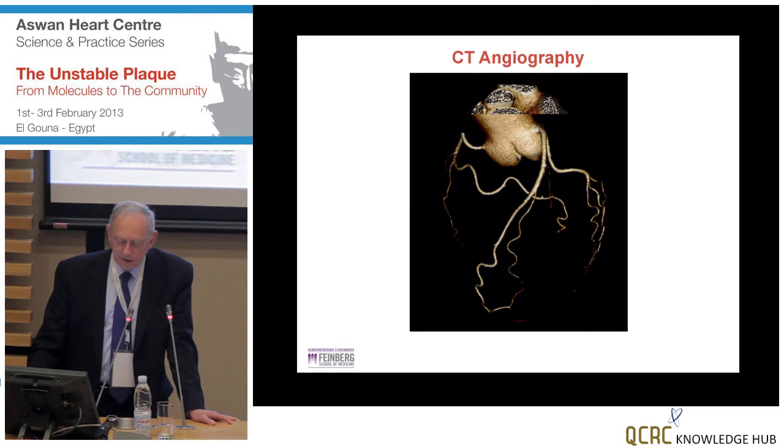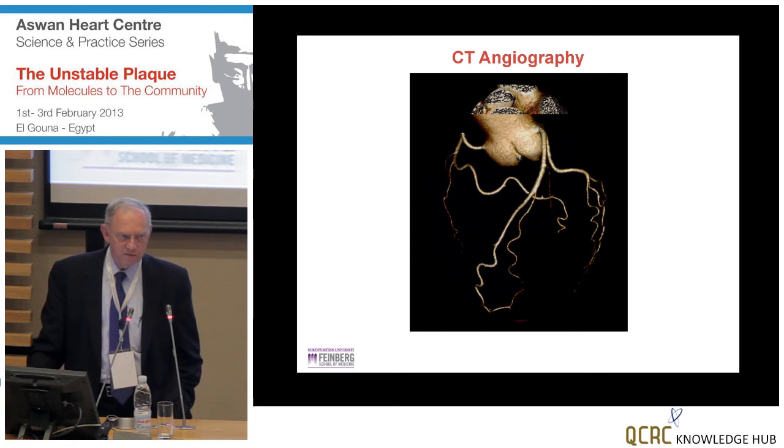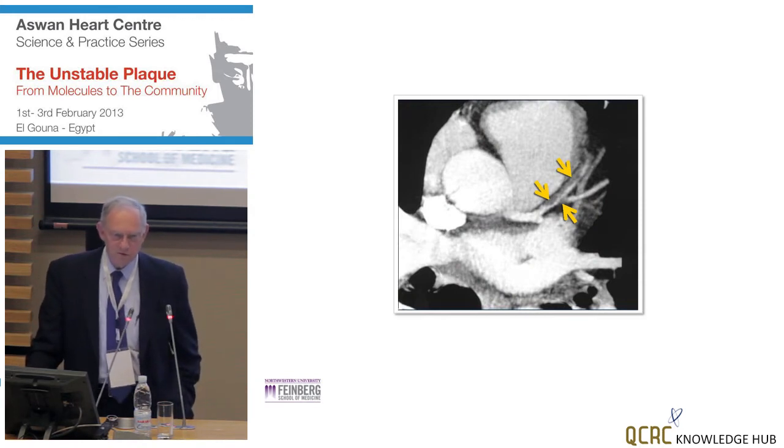Moving beyond the CT calcium, of course, maybe there's more information one can get from CT angiography, because we do have the attainment of the holy grail now of the non-invasive coronary angiogram, not only to look at the lumen, but also to look at the vessel wall, as was discussed yesterday, because we can visualize with CT not only the calcified plaque, but also the soft plaque.